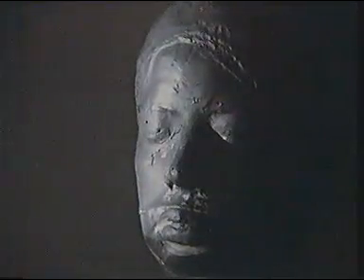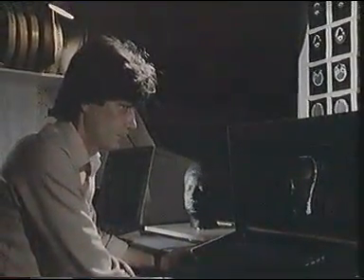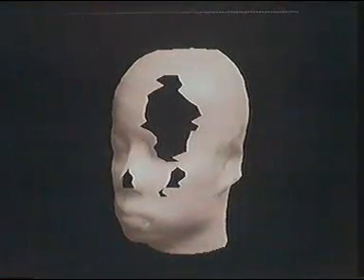Nearby at the Slade School of Art, a powerful mini-computer will soon help this process. From this demonstration head with a real skull inside, a model is produced by the computer which uses data taken from these special X-ray pictures. Real patients will be scanned by harmless beams of light.